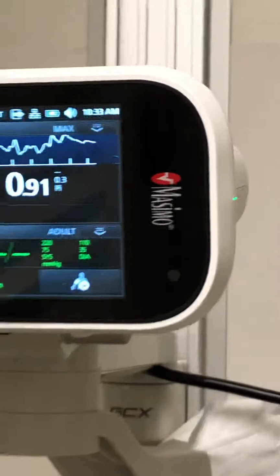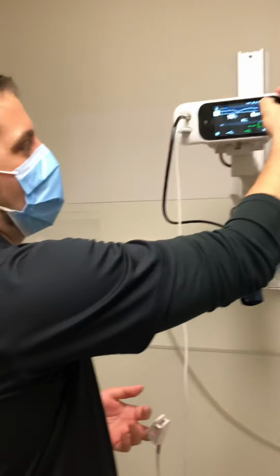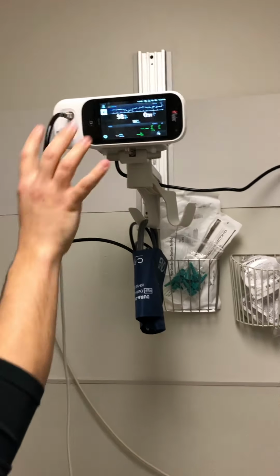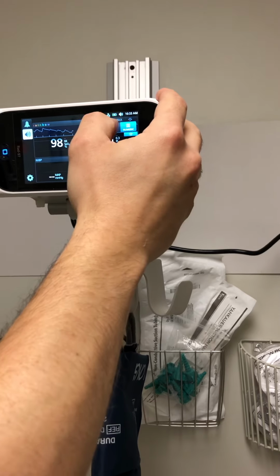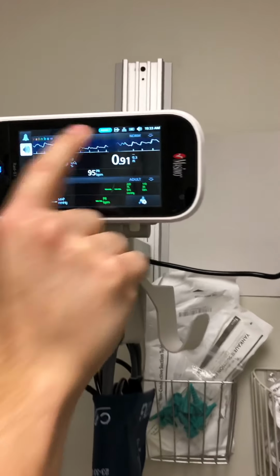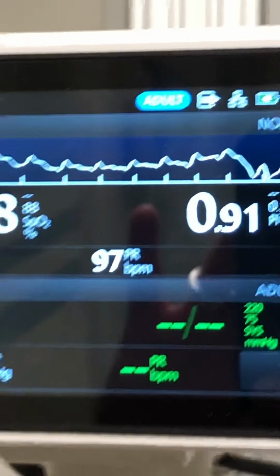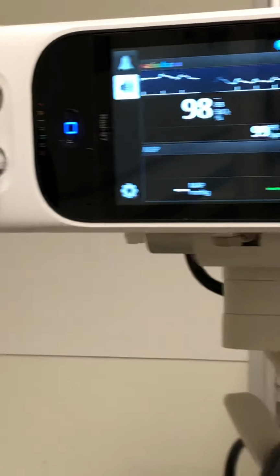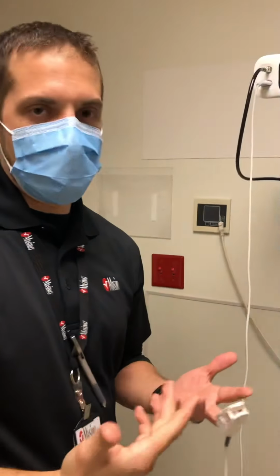Max sensitivity makes this device look 10 times harder for that light source for an SpO2 setting, okay? Make sense? All right, so I don't know if you guys caught that or not, but at the top of the monitors, and I'm gonna switch it back just so you guys can see how it's a light blue background where it says adult, and additionally over here on the power button, it's a light blue square. That's what we call a profile. Profiles are our way of defaulting the settings for the monitor.